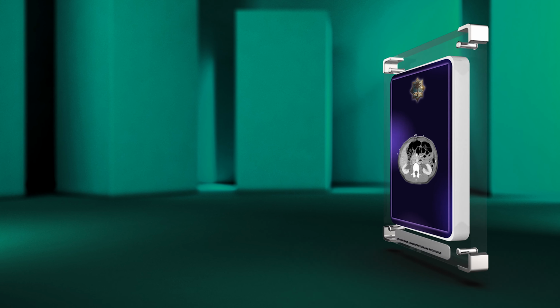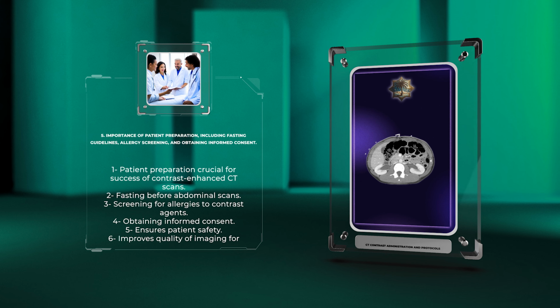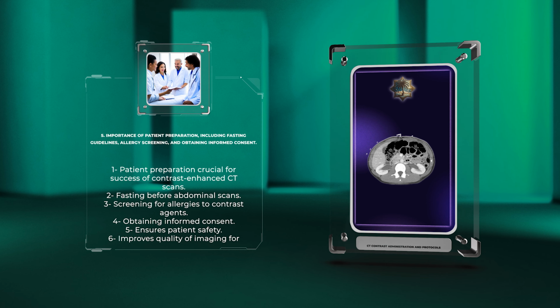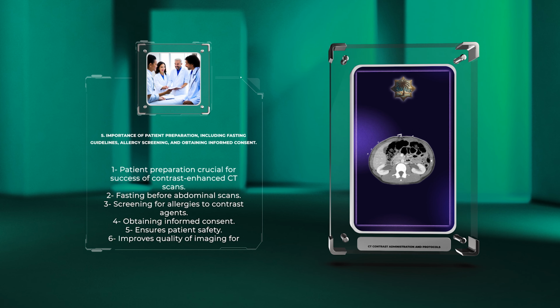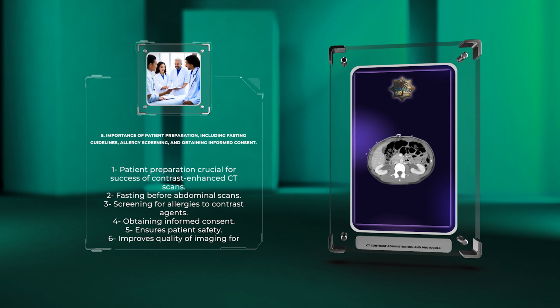Patient preparation plays a crucial role in the success of contrast-enhanced CT scans. It involves fasting before abdominal scans, screening for allergies to contrast agents, and obtaining informed consent. These measures ensure patient safety and improve the quality of imaging for accurate diagnosis.